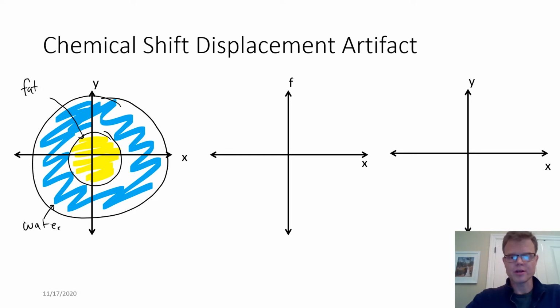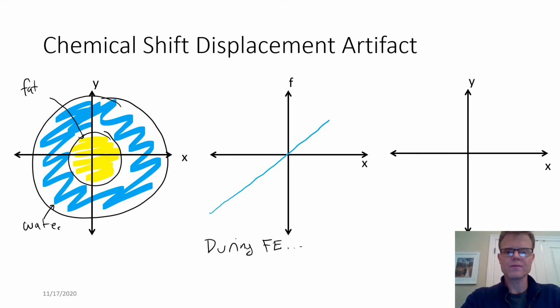Let's draw on here to illustrate what's happening during frequency encoding. I'm going to annotate this with the color of water.